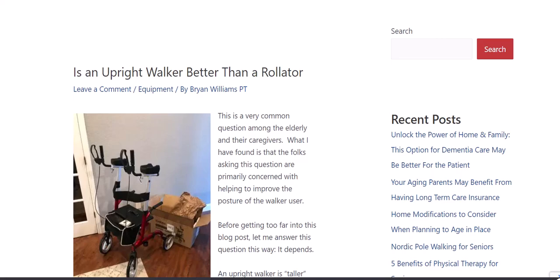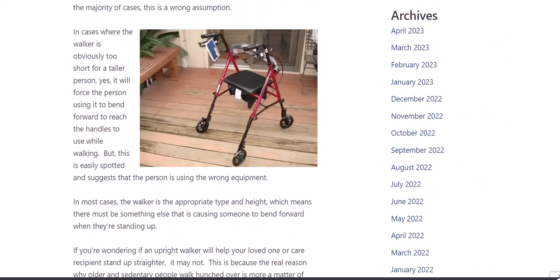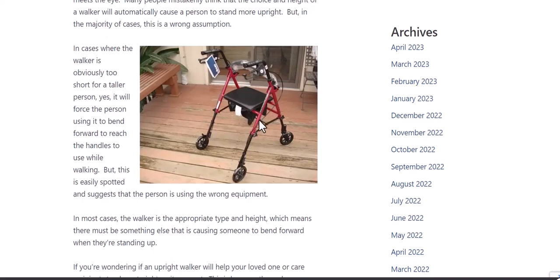Now, an upright walker is the type of walker that you use. They're both four-wheel walkers. An upright walker and a rollator are both four-wheel walkers. It's just that the upright walker is the one that you rest your elbows on, and you have your hands in the upright position with the brakes. The rollator walker, as you can see in this photo here, is another four-wheel walker, but again, you use your hands on the handles, configured more like a bicycle than the upright walker.